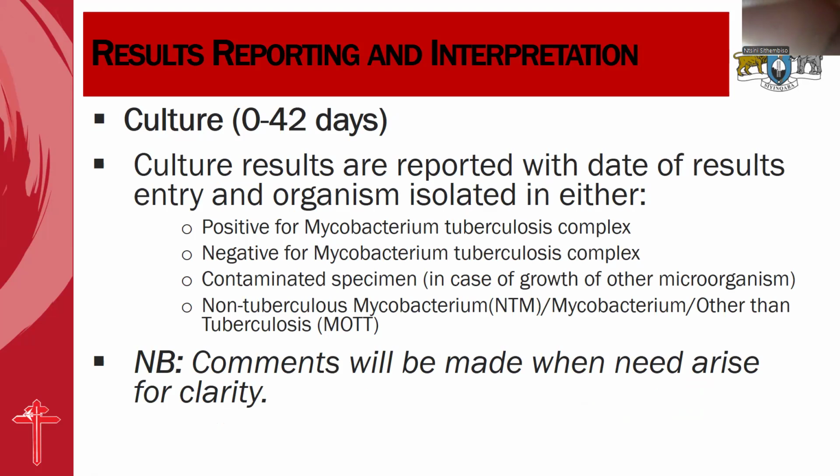In this case, we find that there was a growth, but it was not Mycobacterium tuberculosis growth, so other organisms. It can be non-tuberculous Mycobacterium, or the NTM. So this one, it's a TB, but it's not the Mycobacterium tuberculosis.